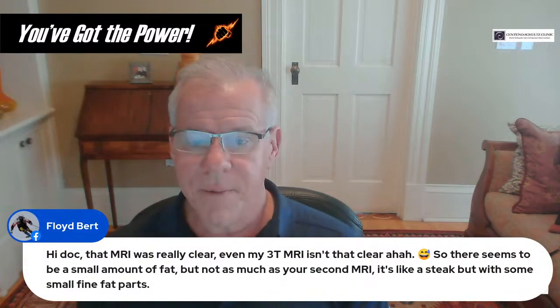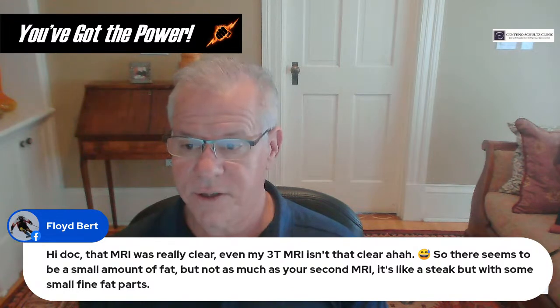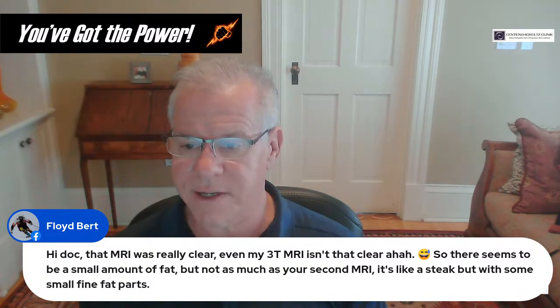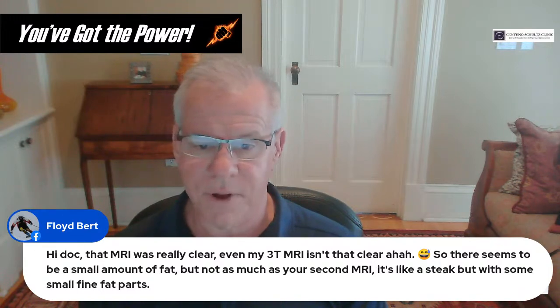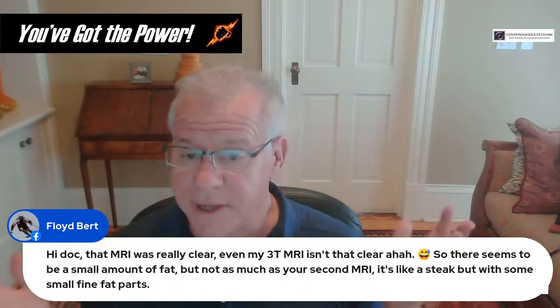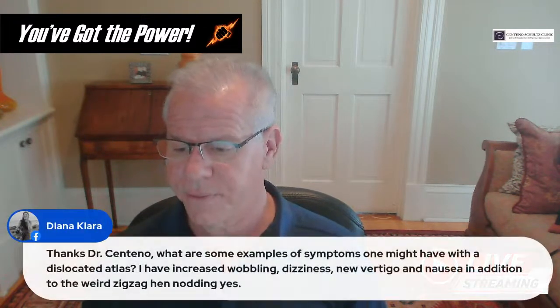Floyd: Hey doc, my 3T MRI isn't that clear. So there seems to be a small amount of fat, but not as much as your second MRI. It's like a steak with some small, fine fat parts. Yeah, so that just means that the atrophy is not as severe, which is a good thing.